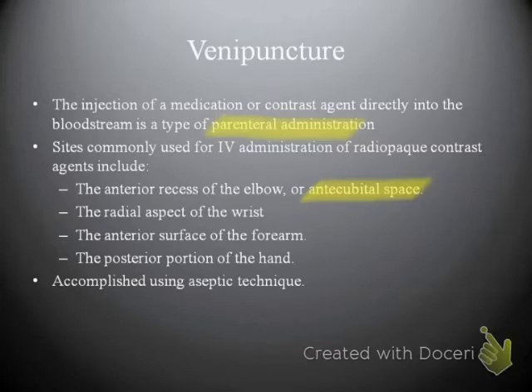Primarily for high flow rate scans, which require a larger needle, it's usually advisable to go for the antecubital space. And we have to understand that venipuncture is accomplished using the aseptic technique.